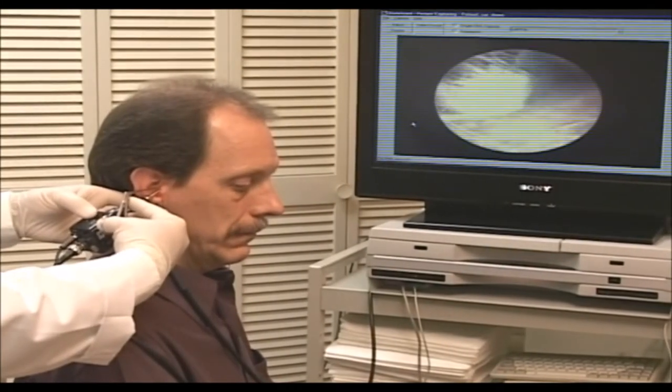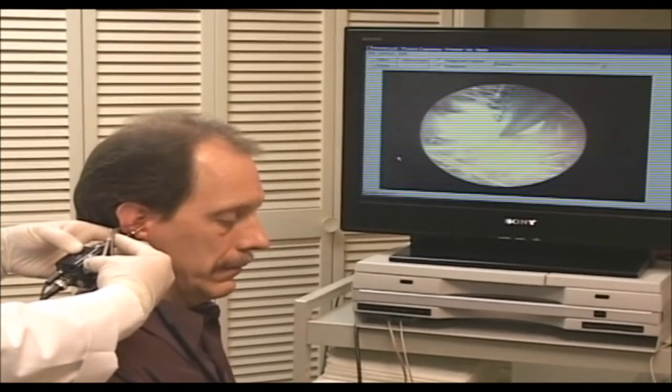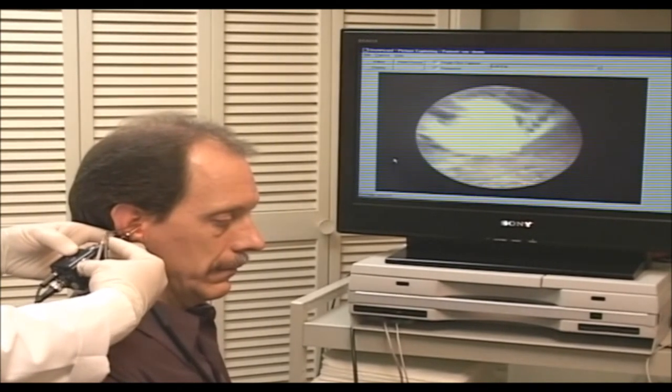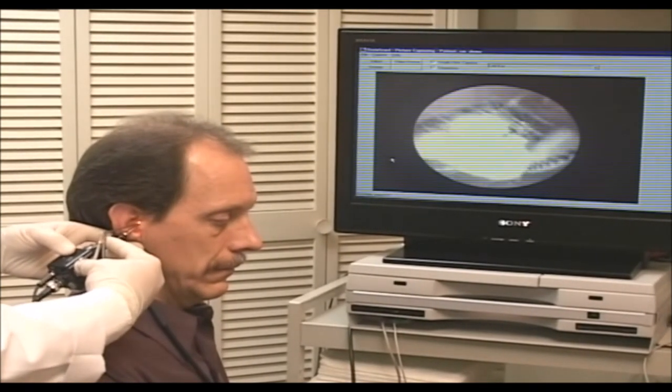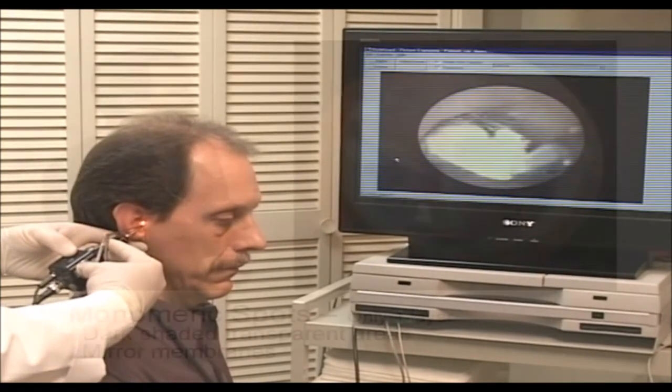It has the tip closed. I'm going to very gently open. And before it closes, I have to see what I'm grabbing. I just grabbed the paper. I'm very gentle. Never close the tips if you don't see the tips.